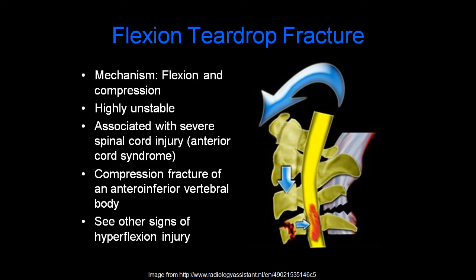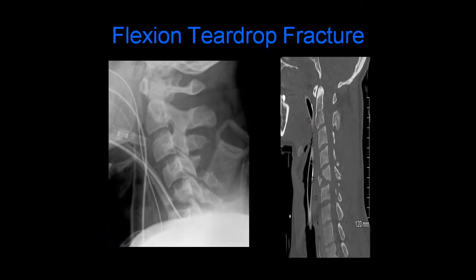A flexion teardrop fracture is a serious type of injury which occurs with flexion and compression. This is highly unstable and is associated with severe spinal cord injury, most often the anterior cord syndrome. It is a compression fracture of the anteroinferior vertebral body. You also see other signs of hyperflexion injury. Here is an example showing a kyphotic deformity and a compression fracture of the anteroinferior aspect of C5, with the corresponding CT scan image.